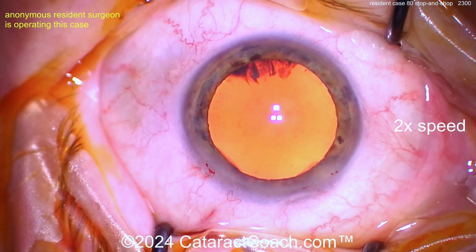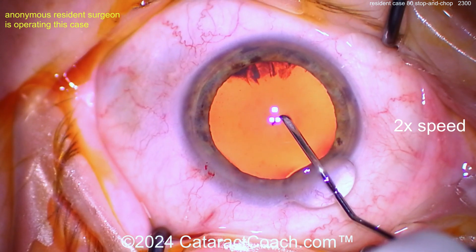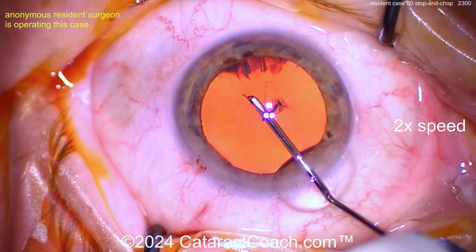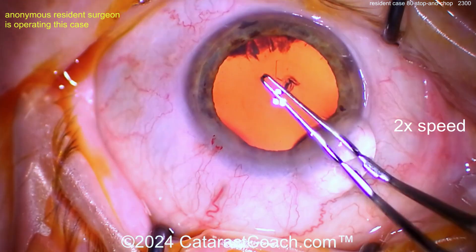I just prefer to be just a fraction of a millimeter more posterior. Now let's see the rhexis being done here — poking on the cystotome. I like how the Purkinje image is right in the center of your field, so you're keeping that pretty well centered. Got a nice flap turned over.